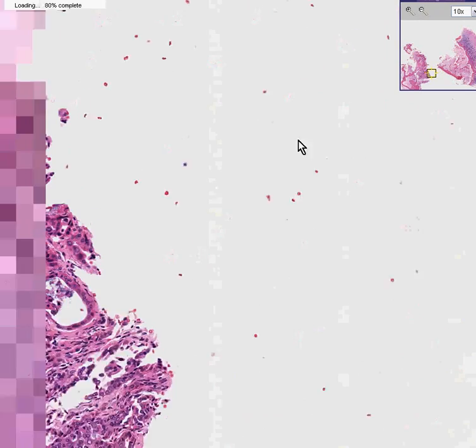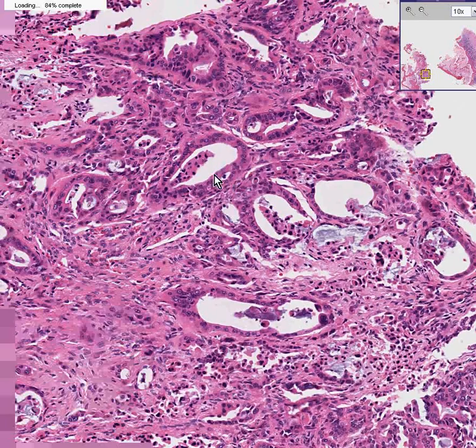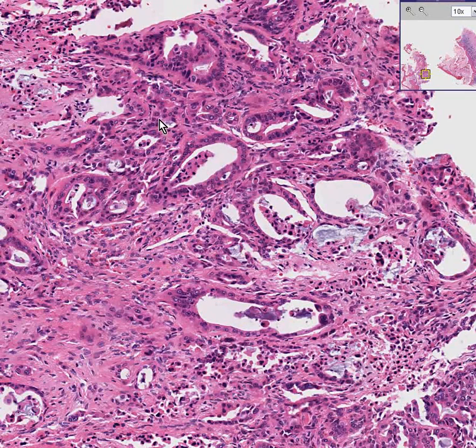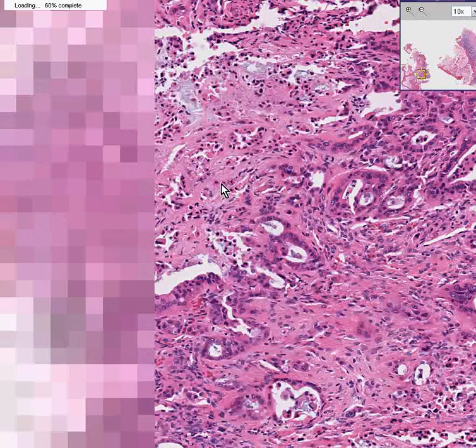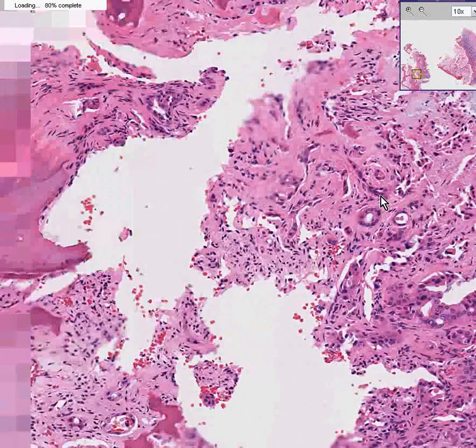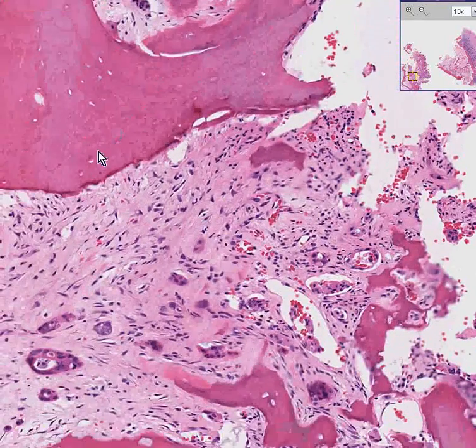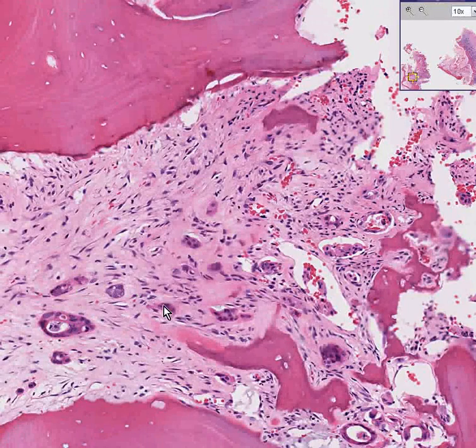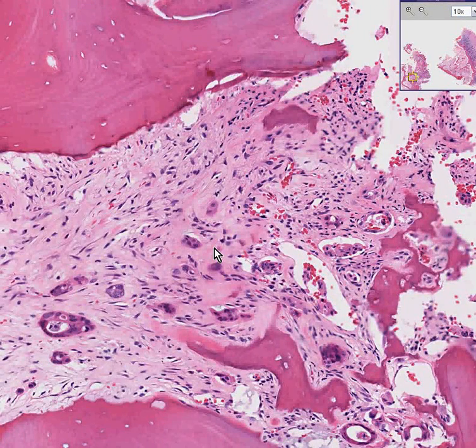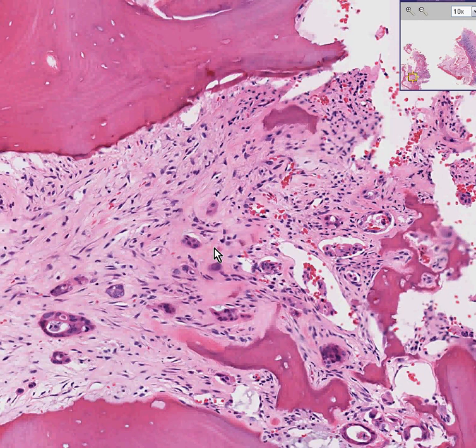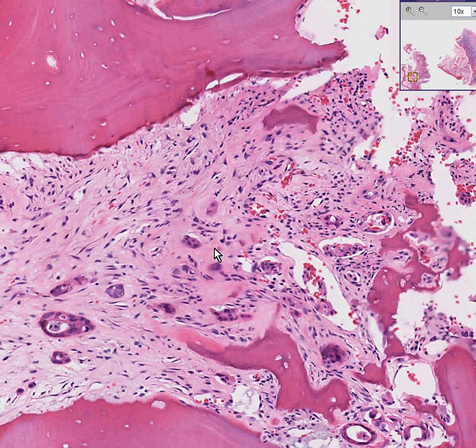I think you'll instantly see a whole bunch of glands here as well. You might ask how do we know this is bone — well, if you follow the tissue to the edge, you may be lucky enough to see some bony spicules, which you do see here. And even in areas where there are bony spicules, you can see little glands throughout. 90% of the time when widespread metastatic carcinoma involves bone in a male, the prostate is the primary. 90% of the time when it involves bone in a female, the breast is the primary.